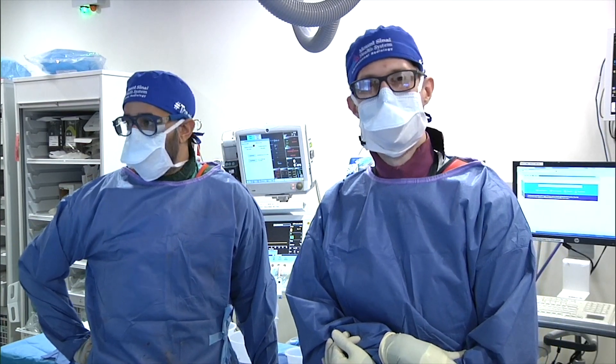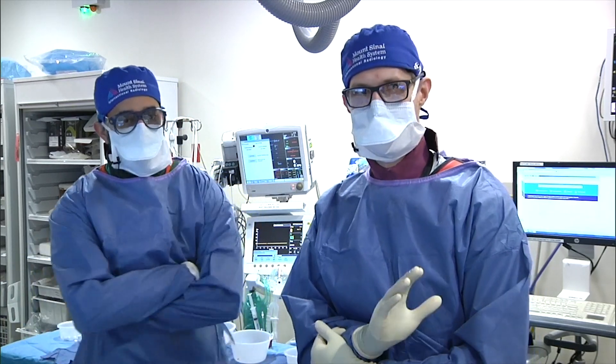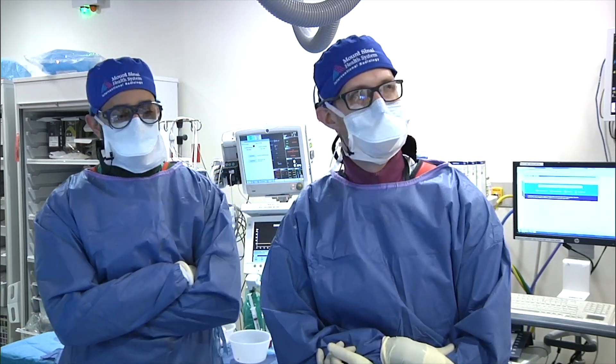Hey guys, sorry for the delay — we're just trying to run through this case pretty quickly here. So I have Marcin Kobler, who's going to be one of our fellows next year, trying to introduce this case.